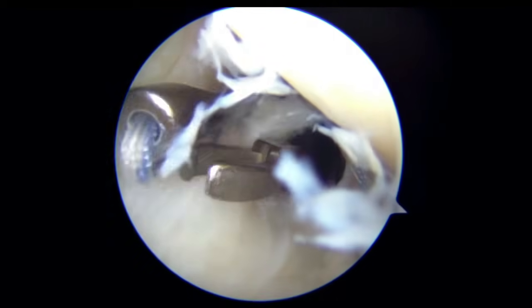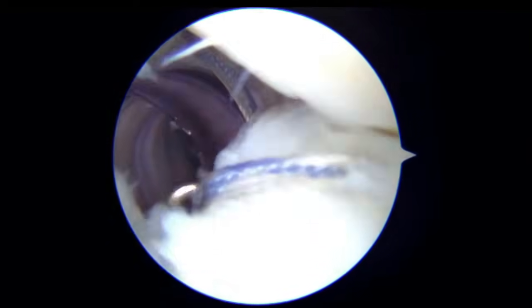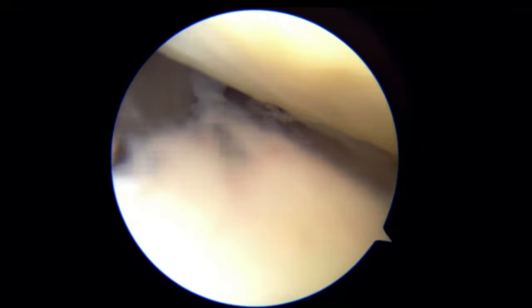So after having both the sutures, the knotting procedure is being done. You put the knots, half hitches, 5 to 6 of them, and then finally cut the sutures with a cutter.